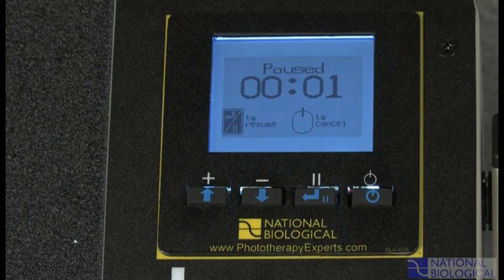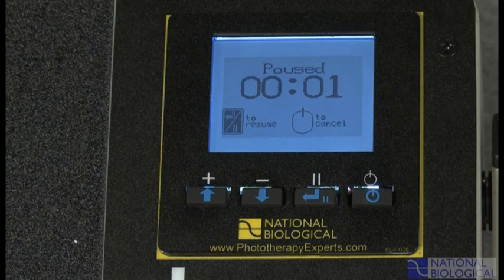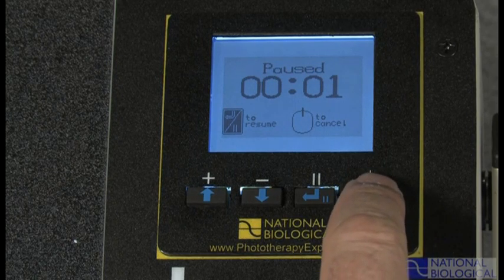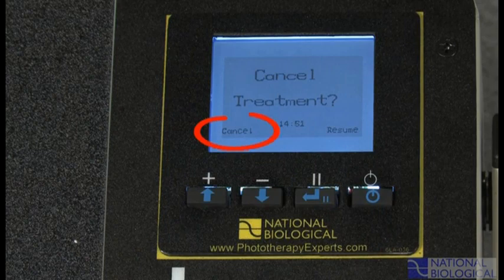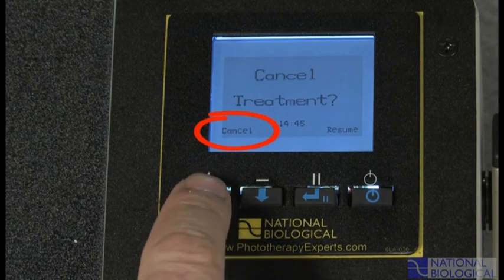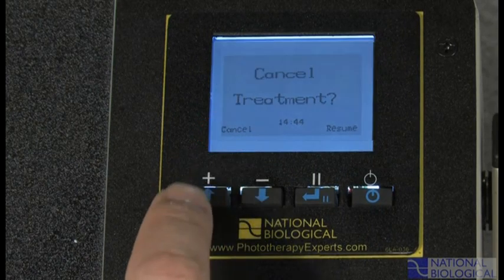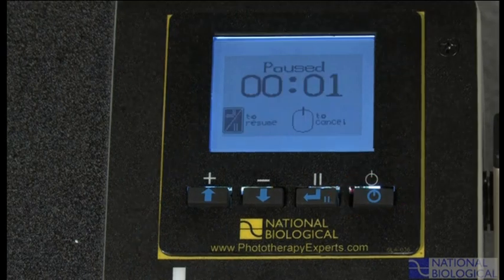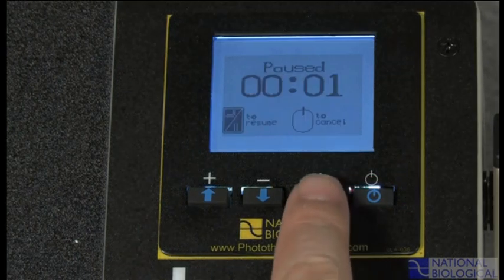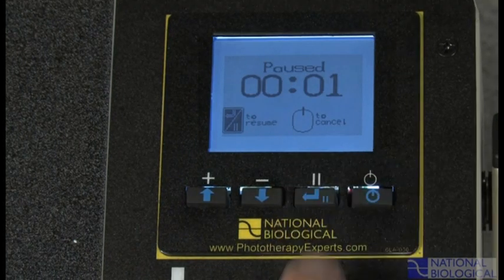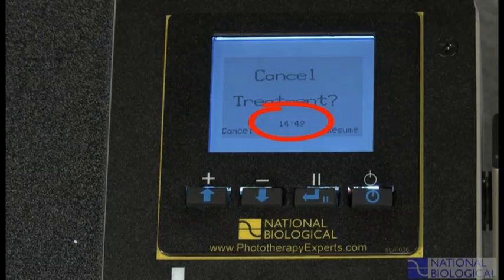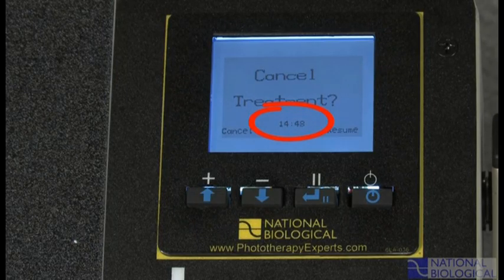To cancel treatment from the pause screen, press off. A cancel treatment screen will appear. Then press up to verify that you want to cancel treatment, or press on to resume. To resume, press pause again. If you do not resume within 15 minutes, the treatment will automatically be canceled.